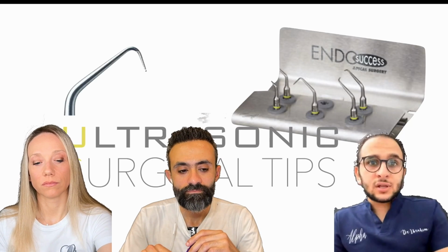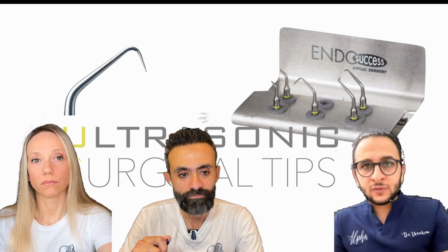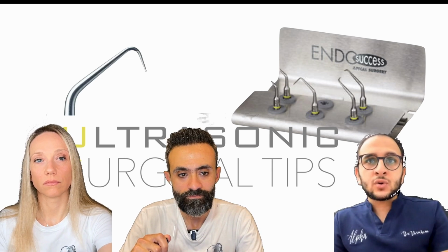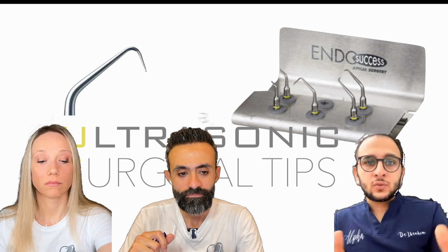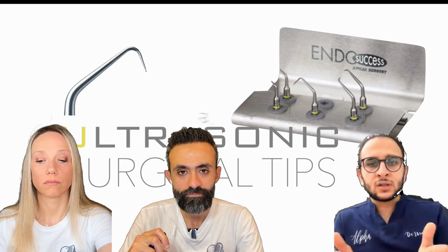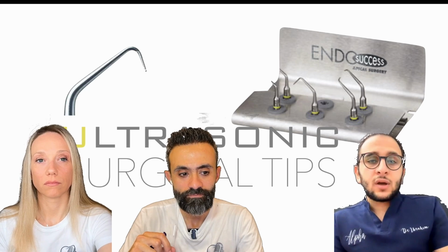When we talk about surgical tips, we are going to talk about a kit which is designed specifically for microsurgery, and we use the whole kit. We open the whole kit during the procedure. We use whatever we want, and after that, we pack it again for the sterilization.